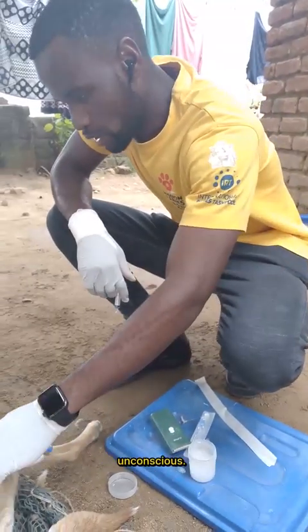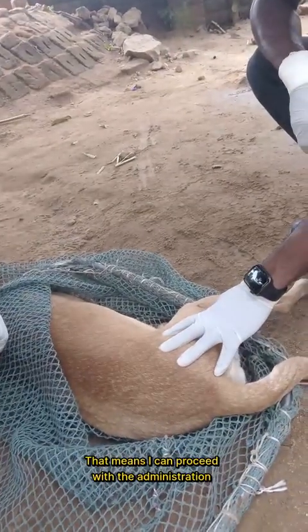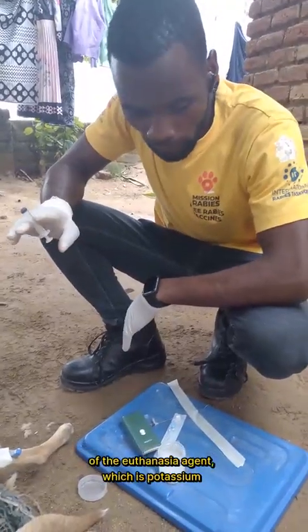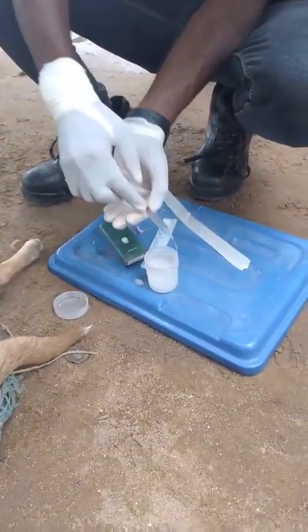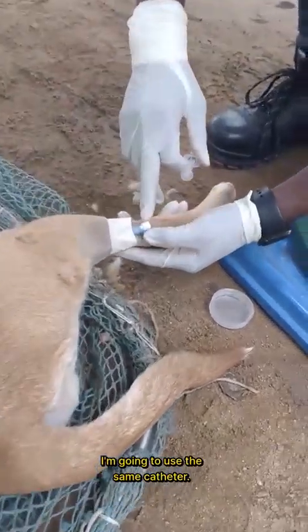Now the dog is unconscious. That means I can proceed with the administration of the euthanasia agent, which is potassium chloride. I'm going to use the same catheter.